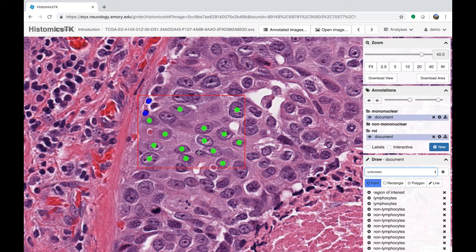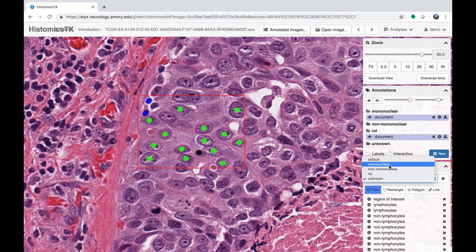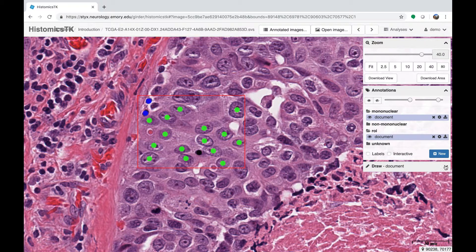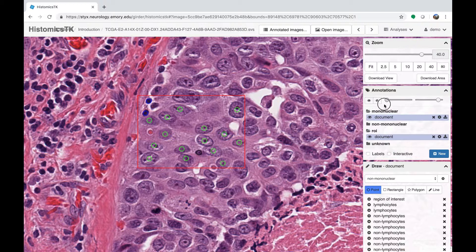For a nucleus that is in-plane but whose type is not clear, label it as unknown. You can go back and catch any missed nuclei. To see more of the slide, minimize the draw panel by clicking the arrow in the upper right corner of the panel. There are also buttons that control the visibility of annotations so you can see the slide underneath.